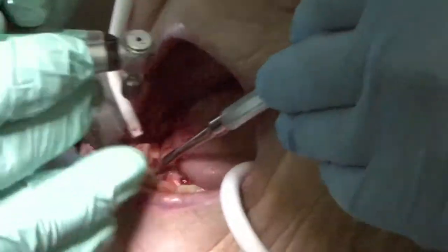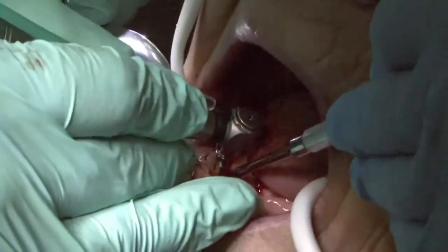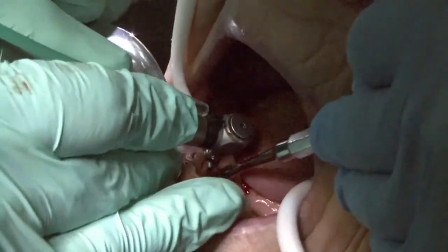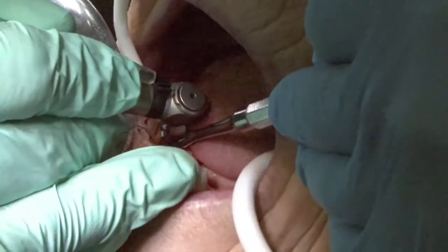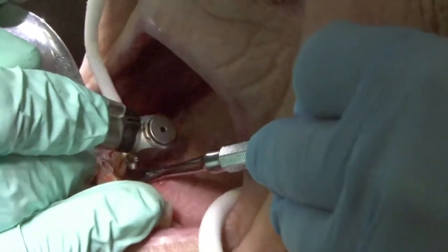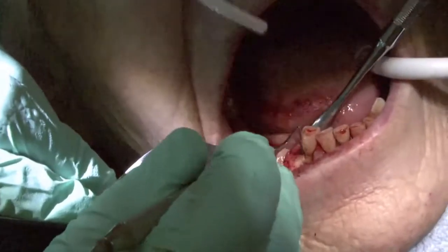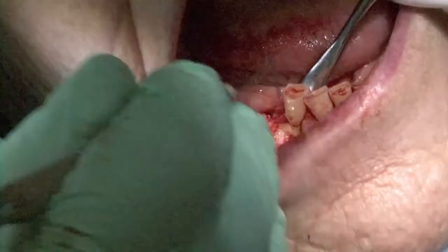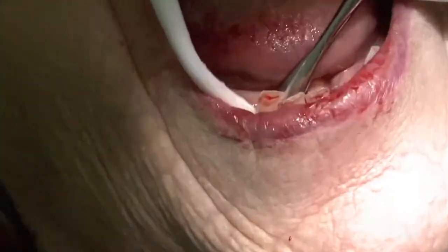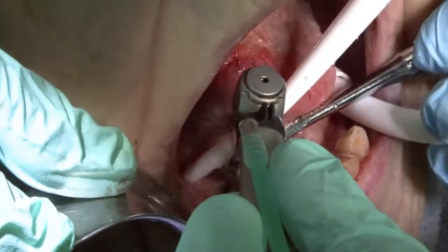We're going to plateau the ridge just slightly, and we're spinning in reverse. You're going to feel a little bit of vibrating, but you should feel no pain. Okay. We're just a little bit off. We're going to move just a little bit further into the middle of our area, and we'll stay parallel to the long axis. Suction on bone, please. That's right, you stay right on the bone.